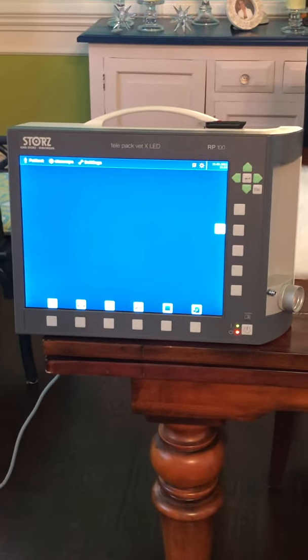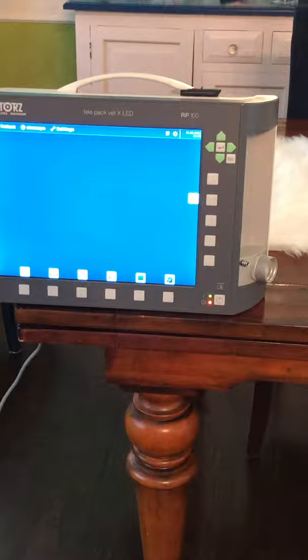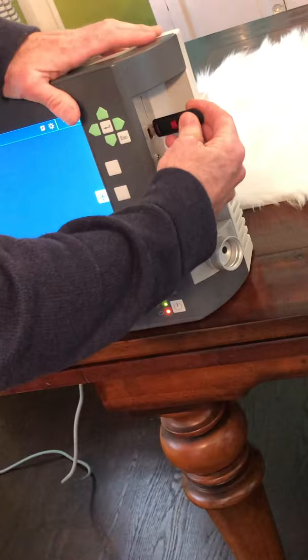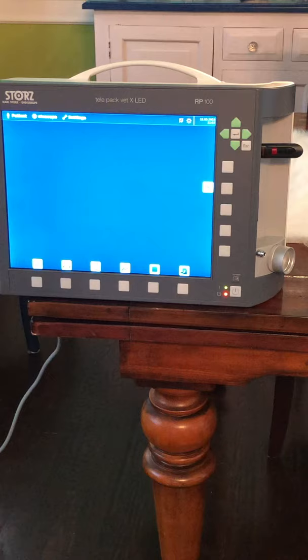I'm going to explain how to hook up this Telepack Vedex LED system to a rigid scope. I've already turned the power button on. The next thing is to take a flash drive and plug it into the side port of the unit. Without that flash drive, you're not going to be able to take pictures or video — there's no internal memory.